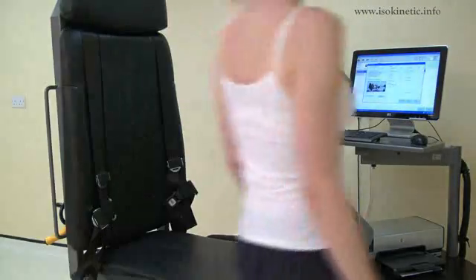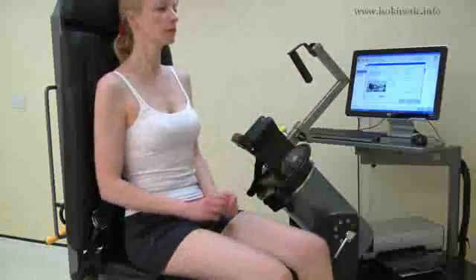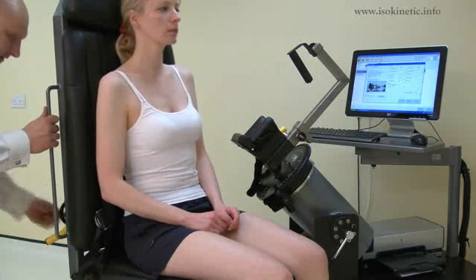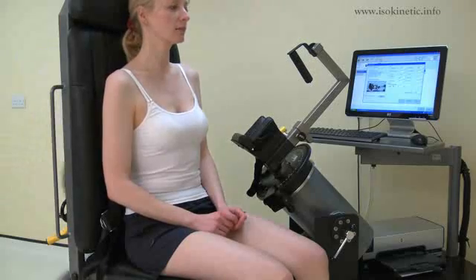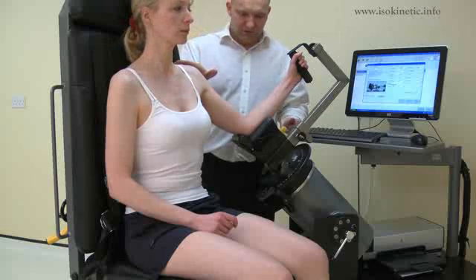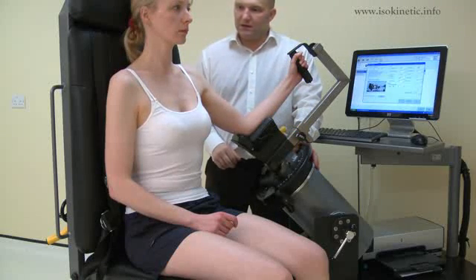Once the norm is positioned, ask the subject to sit on the chair. Adjust the chair back translation for comfort. Place the elbow into the stabilizer. Then adjust the dynamometer height to ensure the shoulder is in a neutral position — that means not elevated or depressed.